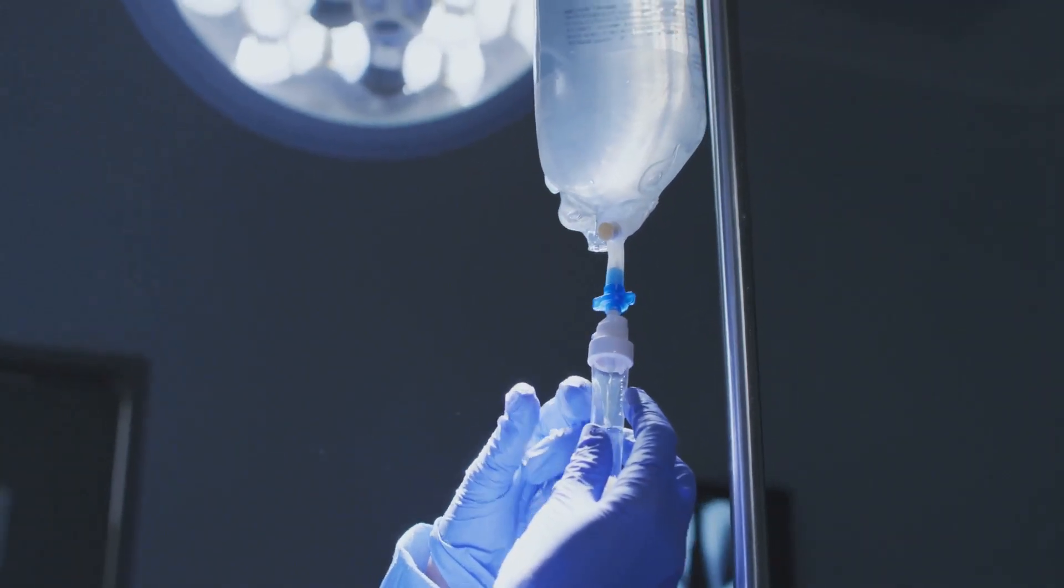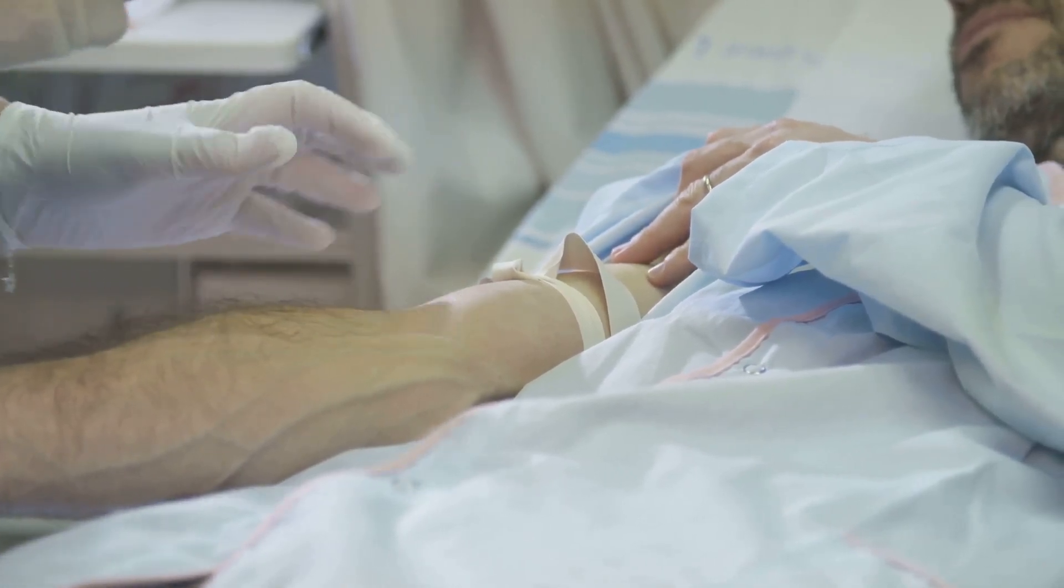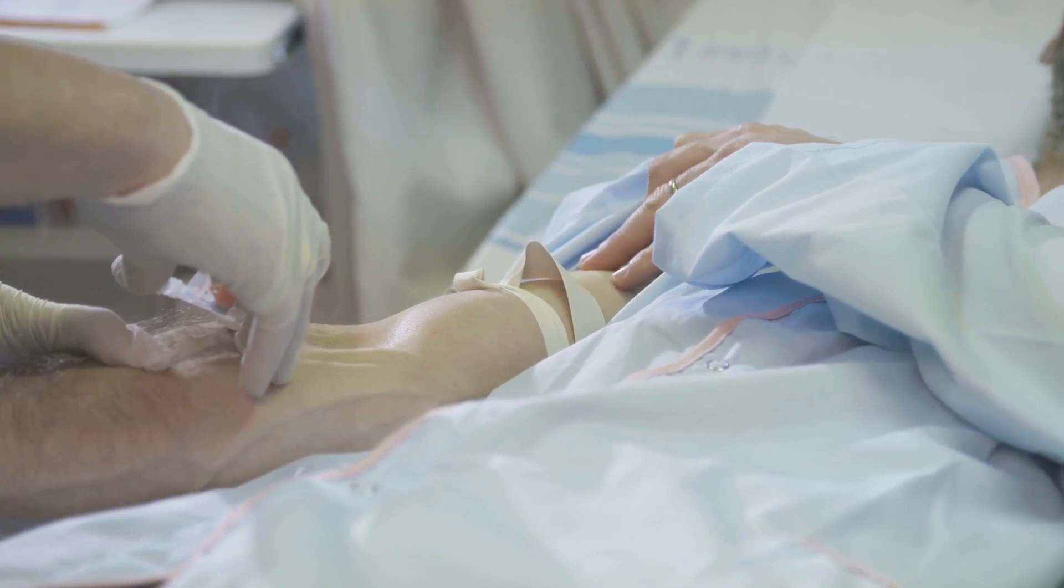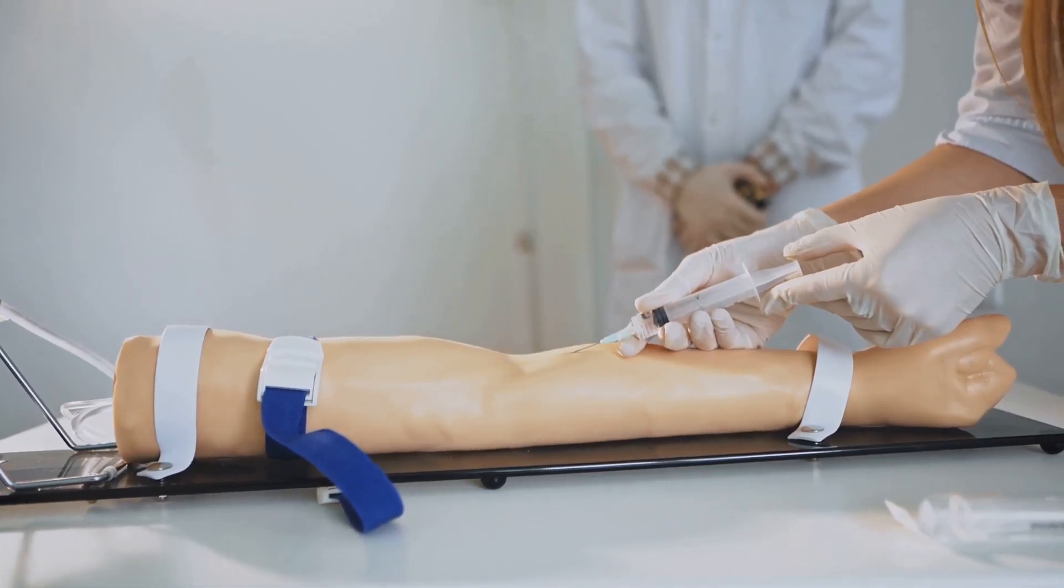Cannulation is a core skill for ODPs. You'll use it every single day in the operating room, helping to ensure your patients are safe and comfortable throughout their surgical journey. So, are you ready to become a cannulation pro? Let's get started!